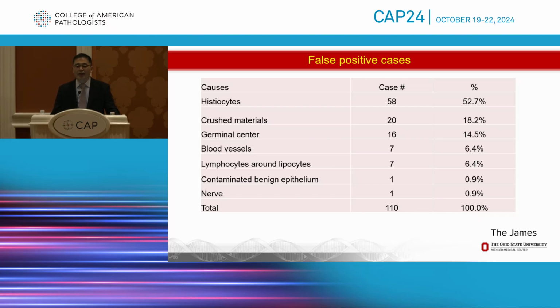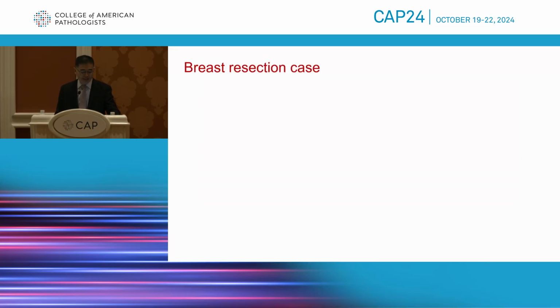But when you have those annotated images, it's very easy and fast. You just quickly review those; you skim through those images pretty fast. And actually, we do not have the data here, but it significantly reduces the time to review those lymph nodes using the AI annotated images.